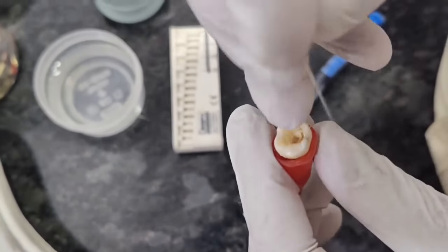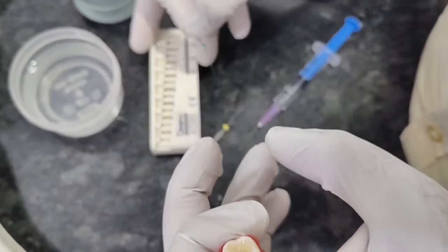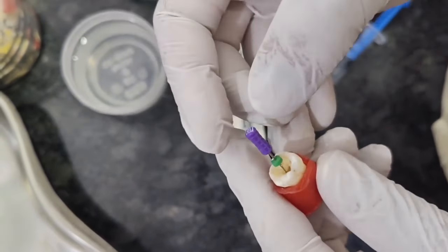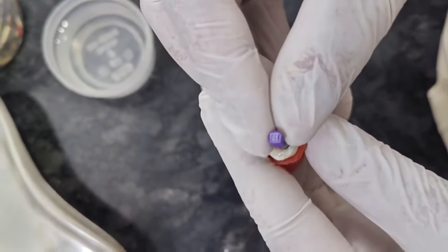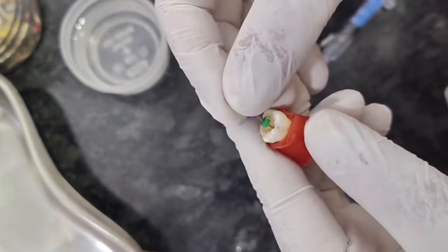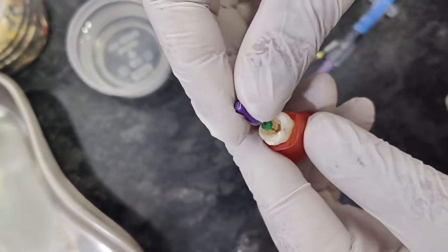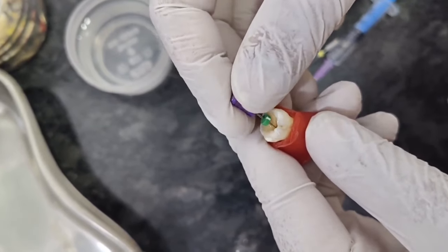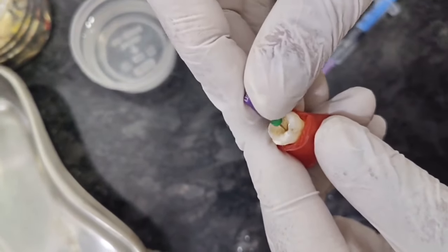So after this, I do the filing with number 10 K file. This is the number 10 file, and we are setting it to 18 mm. So now I am filing with number 10 file. As you can see, 10 is written here. This is also in a watch winding motion. You can either do one canal at a time or three canals at the same time. So I am showing you just one canal. This is number 10. Again, this has already achieved a straight line path. Okay. So now I am free to use the endomotor in the distal canal.